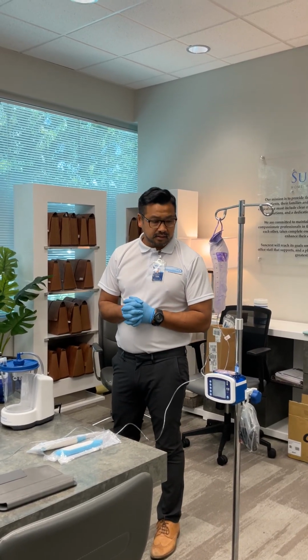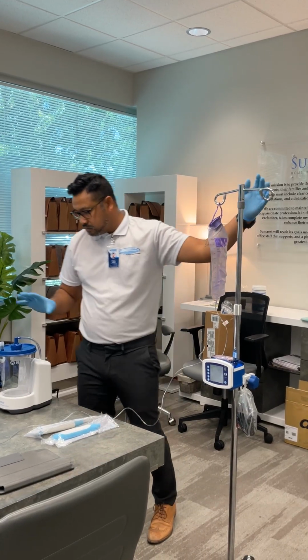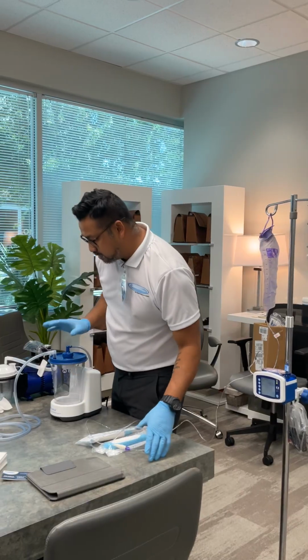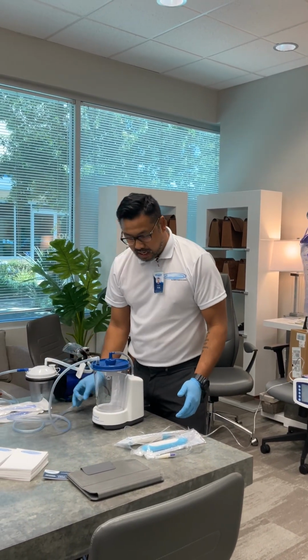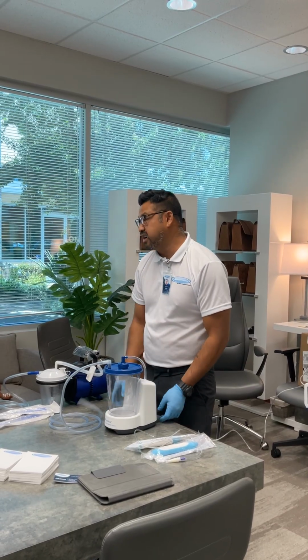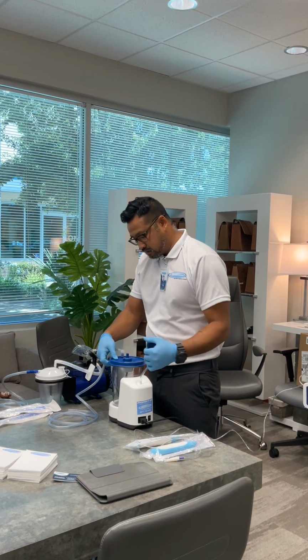All right, awesome. So I'm going to go ahead and move on and start touching bases about this one. As the gentleman was asking, there is a male version of this. It's just a different connection at the end. This is called a Purewick collection unit, and it's for urinary drainage. Very simple unit. Let me take this off.